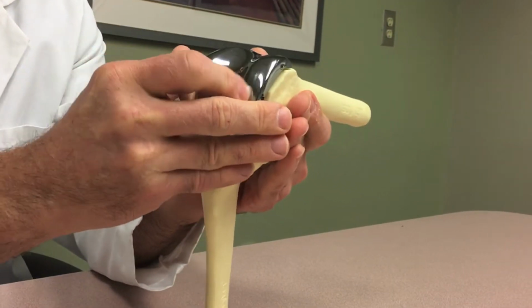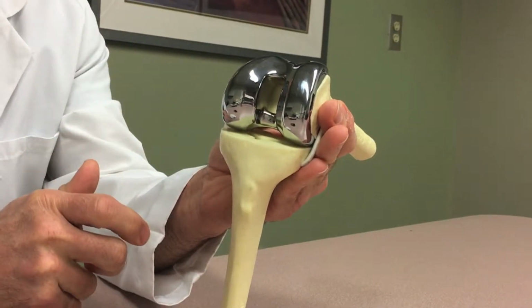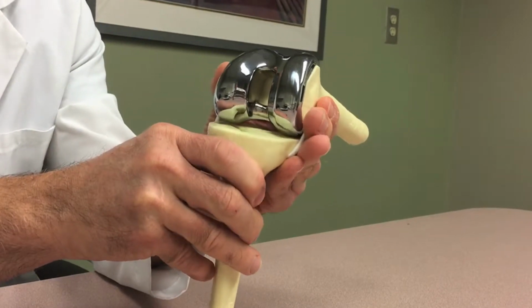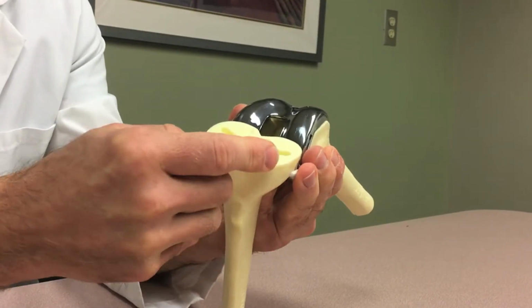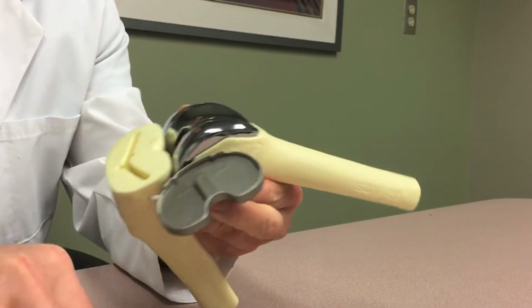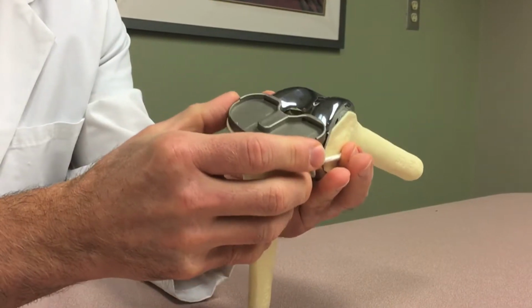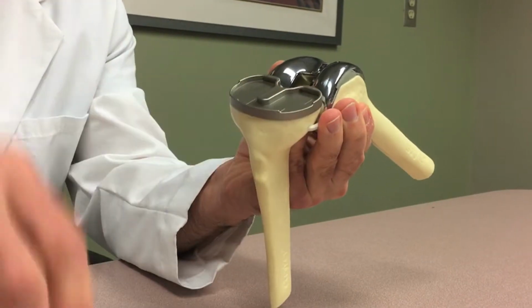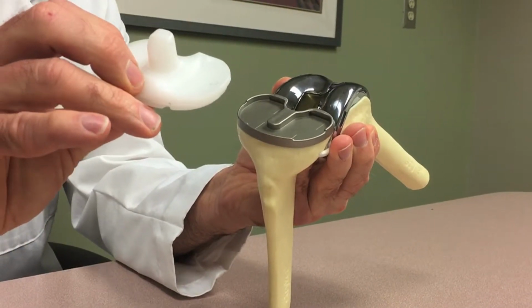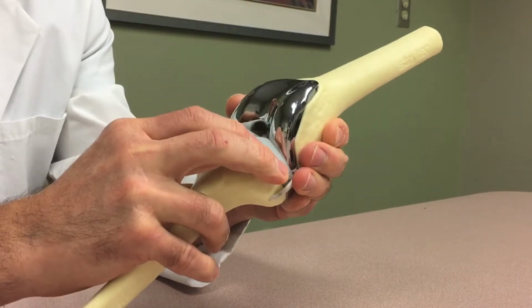We then cement on a metal cap on the end of the thigh bone, and in this cement I put vancomycin and tobramycin, two powerful antibiotics which will leak into the knee joint for 9 months to prevent infection. On the shin bone, we take an 8 to 9 millimeter cut below the bad bone. We then cement this keel and base plate into the shin bone, and then we put what becomes the new cartilage, this highly cross-linked polyethylene, which is a very durable plastic, into the joint, and that becomes the new cartilage.